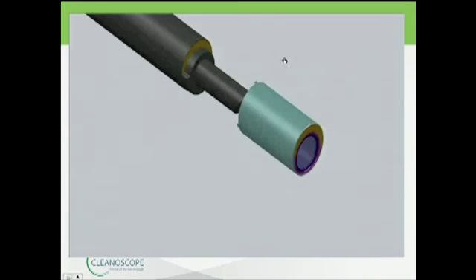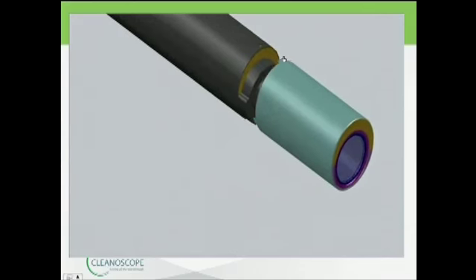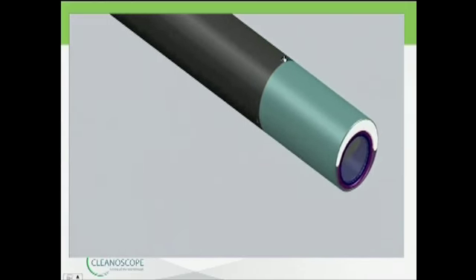I'll stop it there for a second. Pay attention to these little prongs here. This will click into the scope. The design is that it will click into the telescope. You'll see the light come on as it clicks on, because the light has been directed to an upward position so that the disc is in the middle of the optics. Once it's connected, the light will come on. To remove this disposable device, there's an instrument that crushes those clamps and pulls it off. When that happens, it breaks the connection between the endoscope and the device, so it can be used only once. The power is about 4 hours of use, and then it has to be replaced.